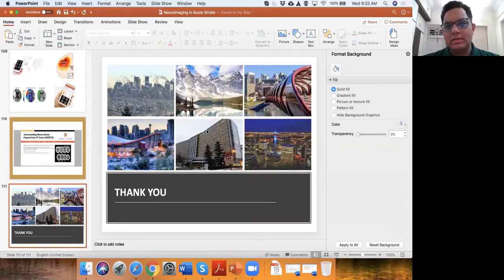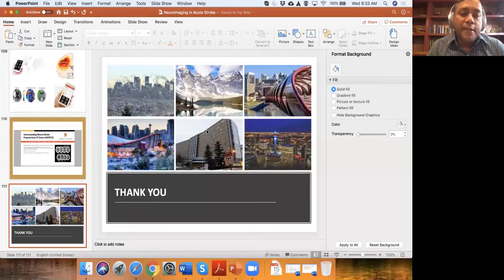Yeah, so the DWI-FLAIR mismatch construct, although we call it black and white, it is not black and white. As somebody is pointing out, there could be subtle FLAIR changes. In my experience, if you see DWI changes in the same region and subtle FLAIR changes, that is less of a problem than when you see clear FLAIR changes.